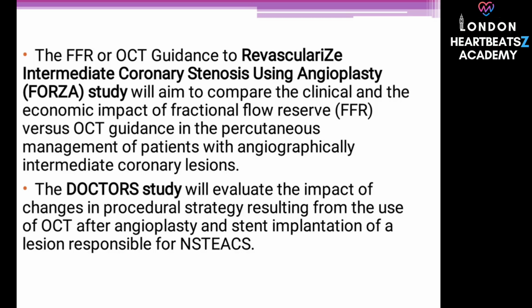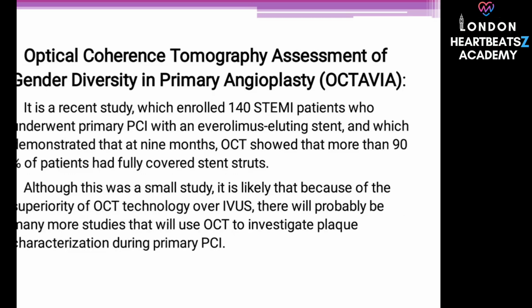The need for contrast flush is another practical consideration. Some patients can't have contrast. And finally, being newer, there's less long-term clinical outcome data compared to the more established IVUS. Less long-term data for OCT. Okay, so it seems like each technology has its own set of strengths and weaknesses, and they might be more complementary in certain situations than direct replacements for one another in all cases.